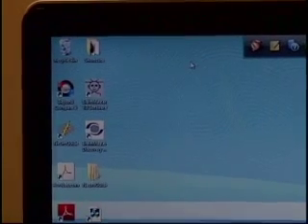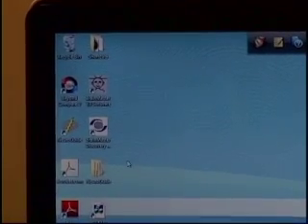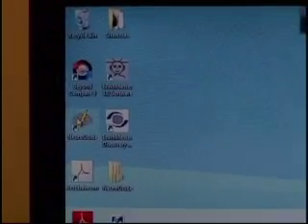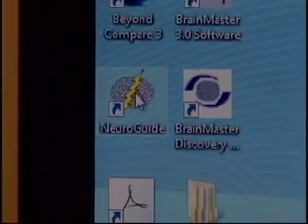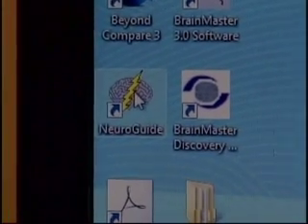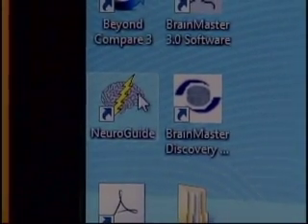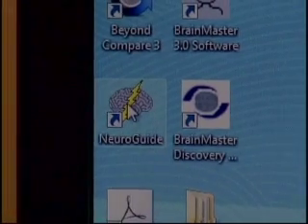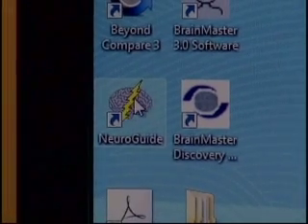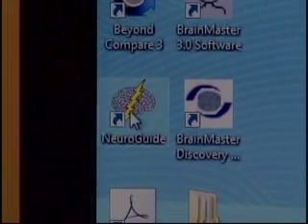We're out of the Brain Master Discovery software, and now I'm going to use NeuroGuide. I happen to have a NeuroGuide icon on my desktop that I can use. Your computer, you may have to use your Start Computer menu.